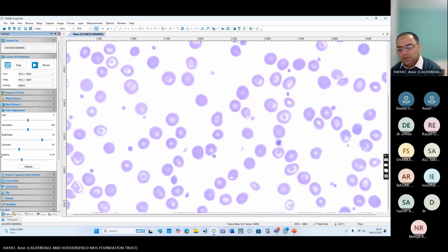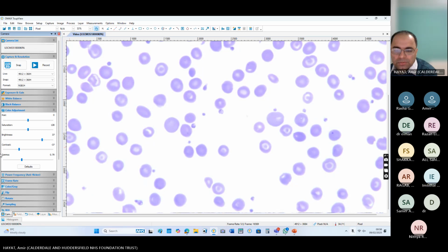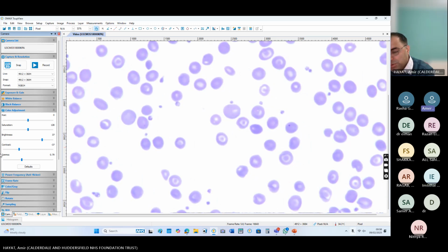Right. Because of splenectomy, they are at risk of 2 major things. One is infection, and what is another risk in a patient with splenectomy? I think maybe thrombosis. Your first point was correct. They are at risk of thrombosis, especially which vein thrombosis?